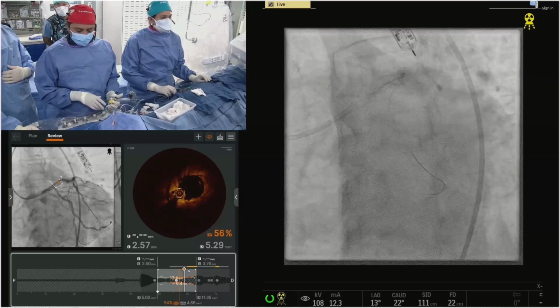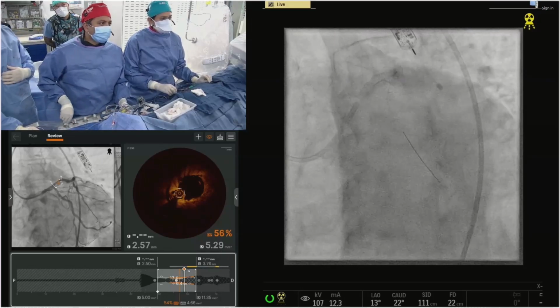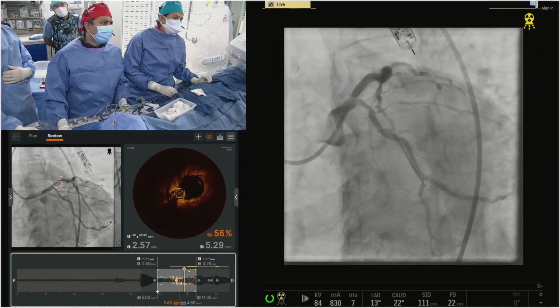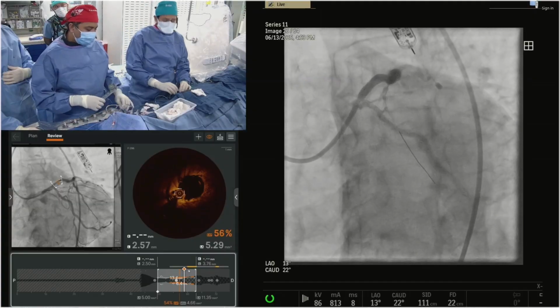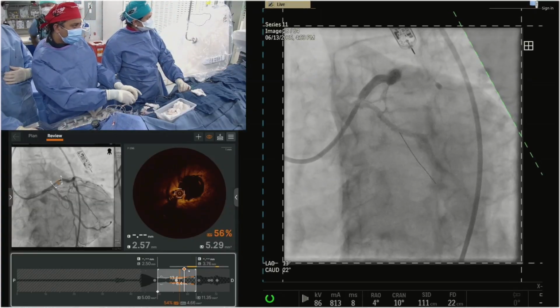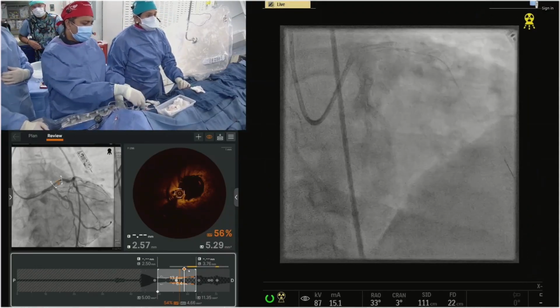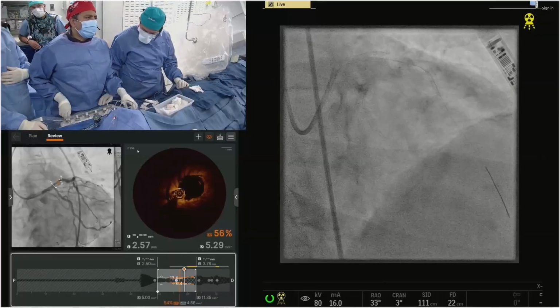Yeah, I think Dr. Singh is right. Stabilize it again. Okay, ready? Yeah. Yay! Okay, everything under control. So it was just bleeding into soft tissue plaque. No need to worry. I don't think another OCT is required. Eyes are telling us things are looking good. You can still see a pocket of contrast there, but it looks like it's contained.